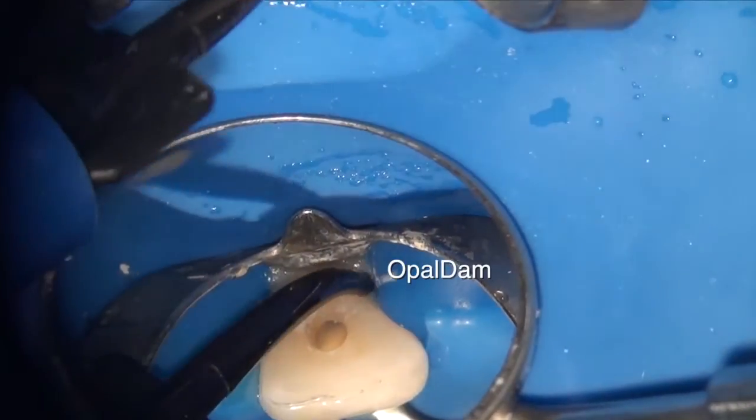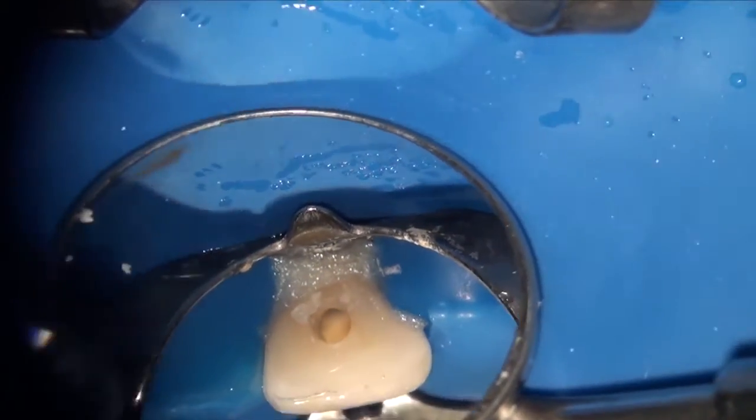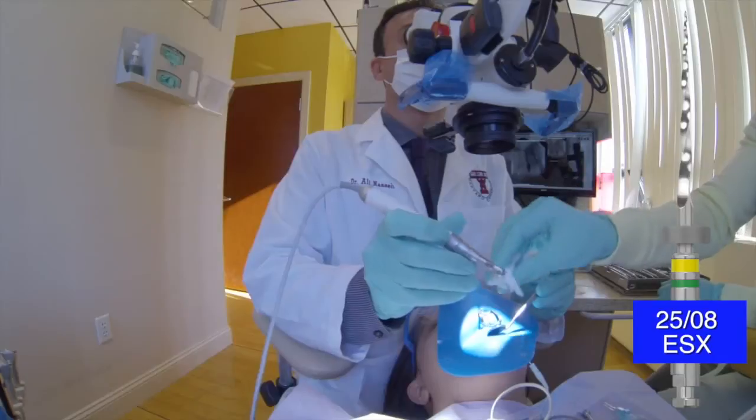Now I'm doing my final isolation. The initial isolation with the rubber dam is basically meant to prevent the patient from swallowing the fluids we use, as well as any potential debris, chunks of filling, or even your files. To do the proper isolation — one that is bacterially and fluid tight — you need to apply a different kind of material here: Opal Dam, in order to completely seal the potential leakage of crevicular fluid around the CEJ of the tooth. I do that here, and then proceed to cure it with my VeloLite from Ultradent, then proceed to do the orifice opening.